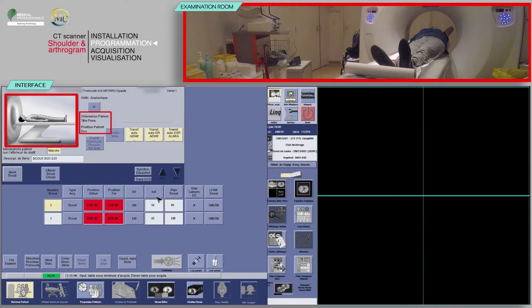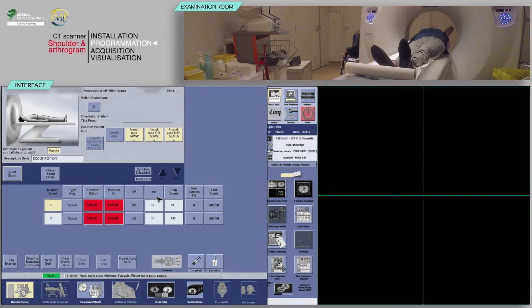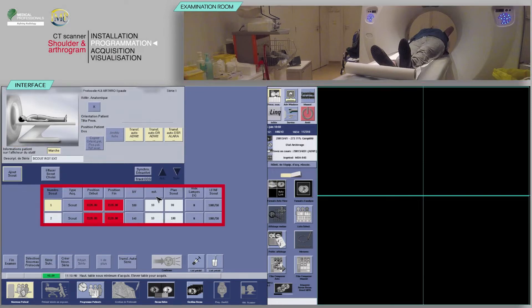Check that the patient's position on the table matches the one indicated. Note that the patient's orientation is head first. After checking the scan parameters, click Confirm.